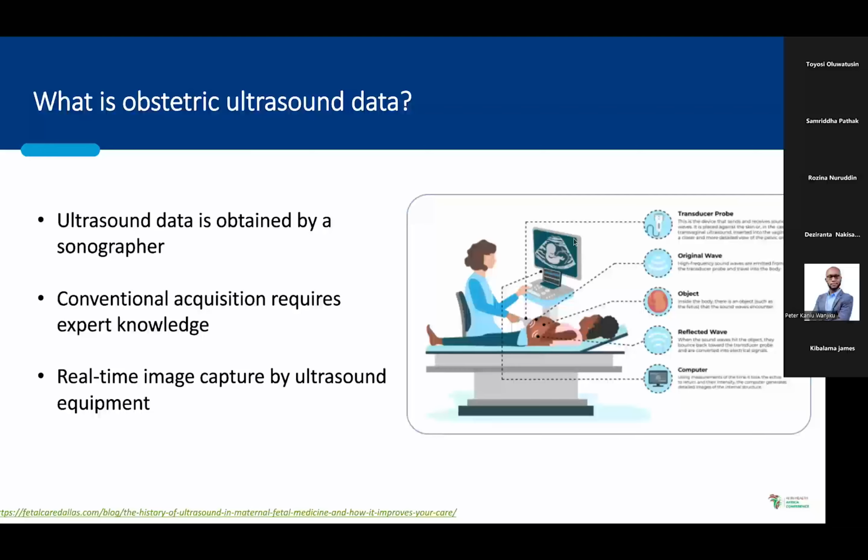So the image captures both the anatomy of the mother as well as the views related to the child. The ultrasound is taken through the knowledge of the experts as well. Yeah, and the ultrasound also provides real-time imaging. So that's a short introduction on obstetric ultrasound data.